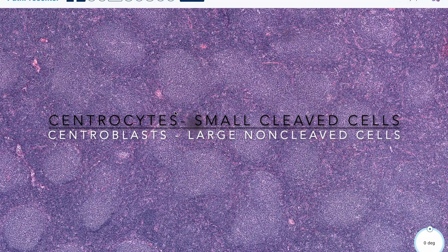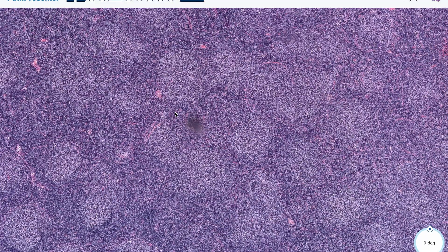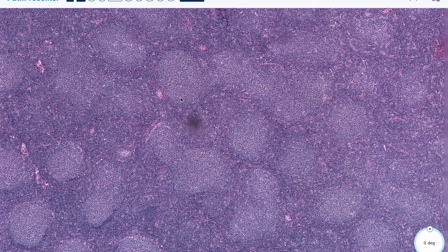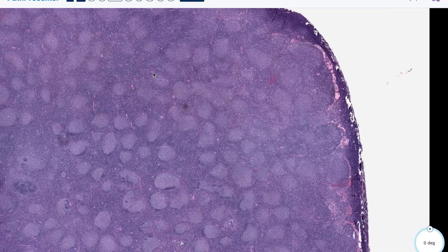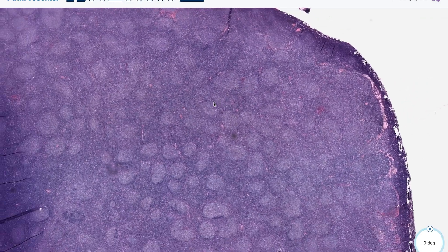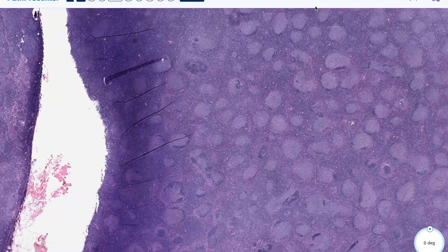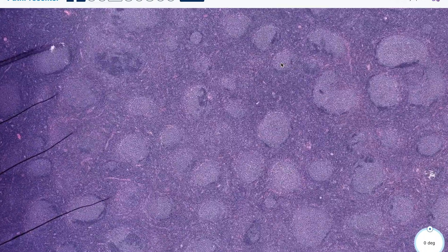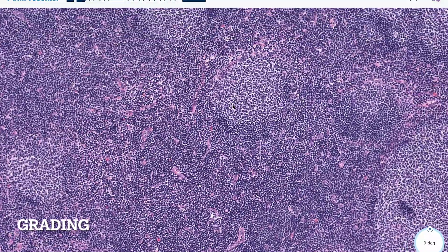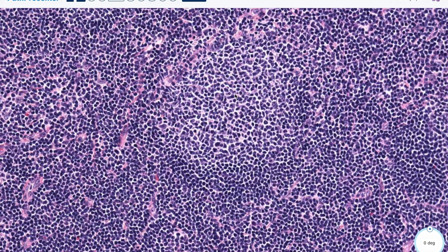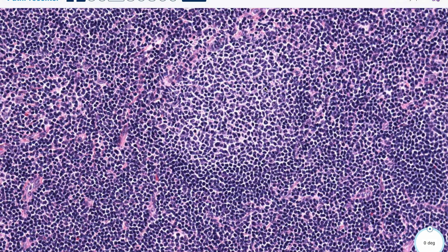The grading of follicular lymphoma is done by assessing 40X fields of 10 randomly selected follicles. You're just going to look around and find 10 follicles — not the 10 worst follicles, but just 10 follicles that you want to take a look at. Then you would go down to 40X and count how many centroblasts you see in a 40X field.